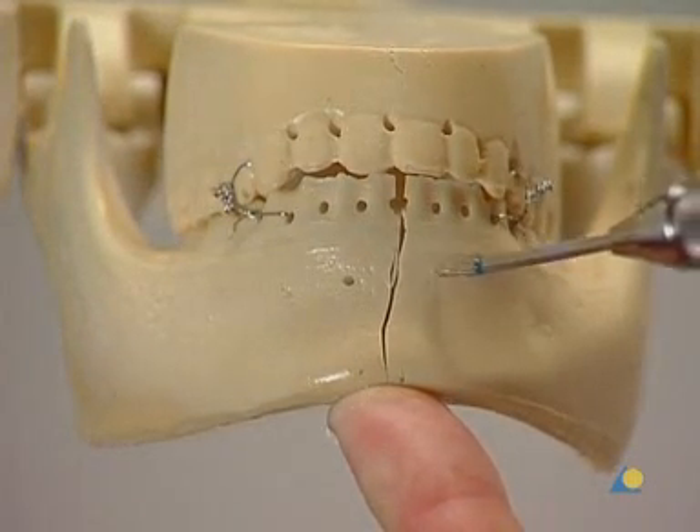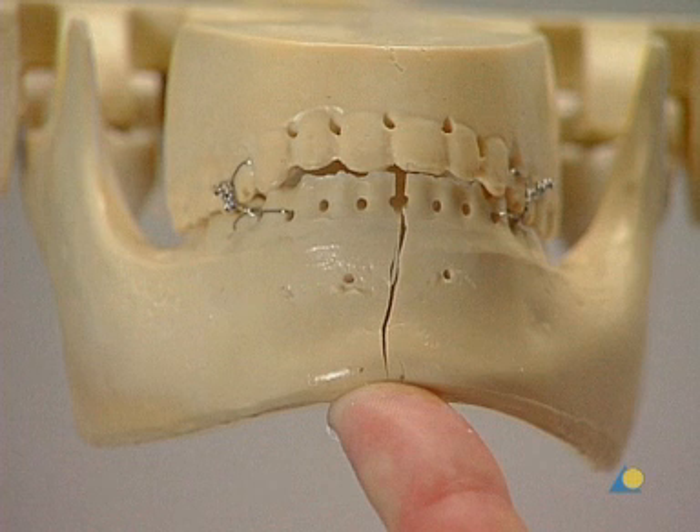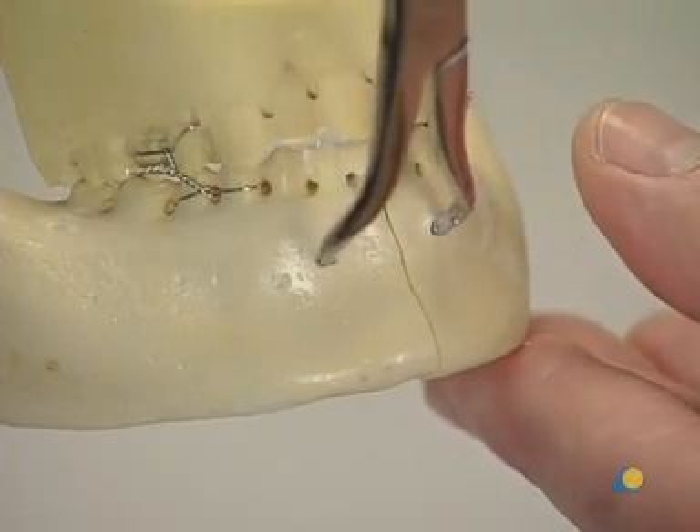The model requires two monocortical holes to be drilled at the superior border on either side of the fracture to help when placing the reduction forceps. In the clinical situation, caution should be taken not to harm the tooth roots. The mandible halves are manipulated until anatomic reduction is achieved.